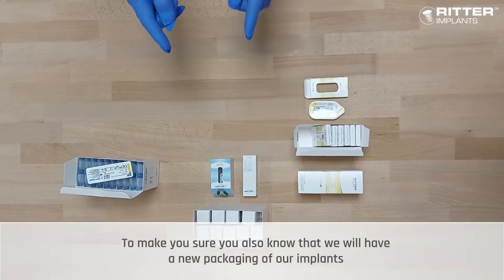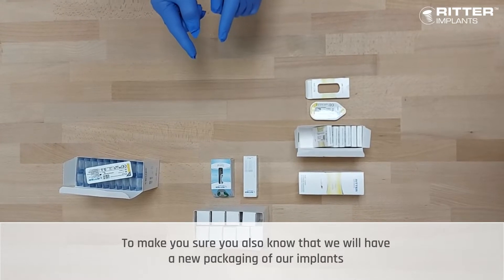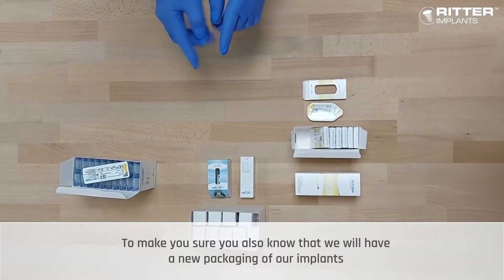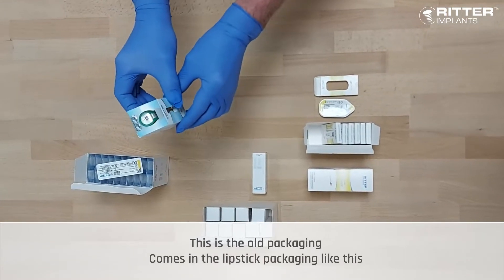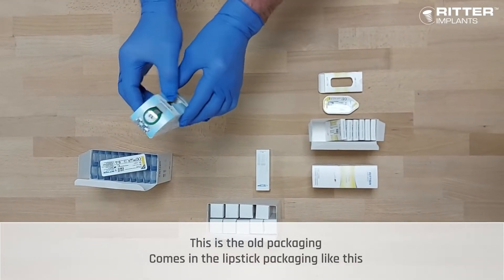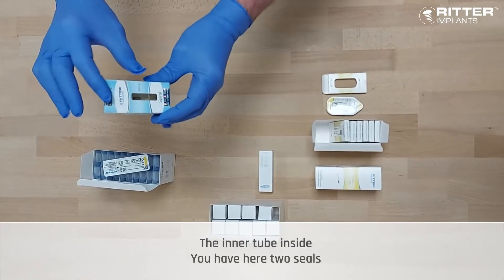Second, to make sure today that you also know we will have a new packaging of our implants. This is the old packaging — it comes in a lipstick package like this. The inner tube inside has two seals here.